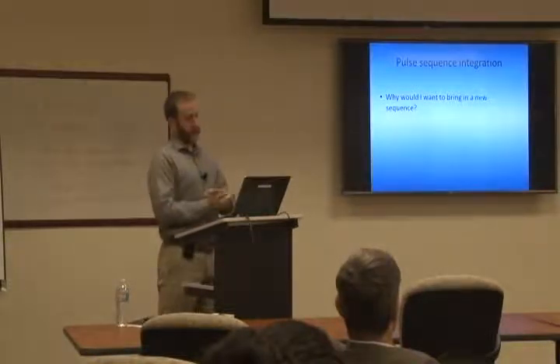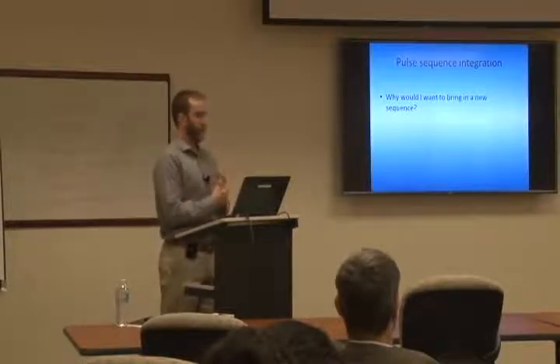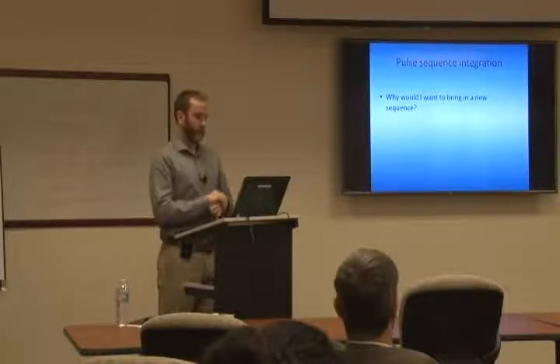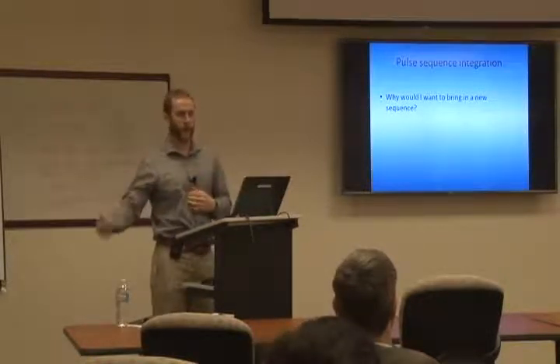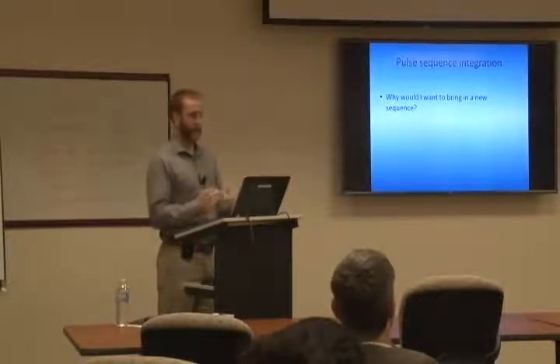Why would you want to bring in a new sequence? You may be happy with the images you're getting, but the reality is that if you're using the default sequences that are on the scanner, you're probably not using the best sequences. It takes quite a bit of time for a sequence to be developed, and the ones that you're seeing on the scanner are the ones that have been tried, tested, and true for a long time, and they're always going to work, but they're not cutting edge.